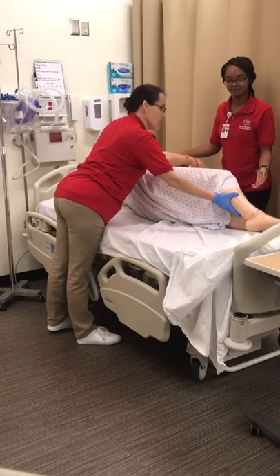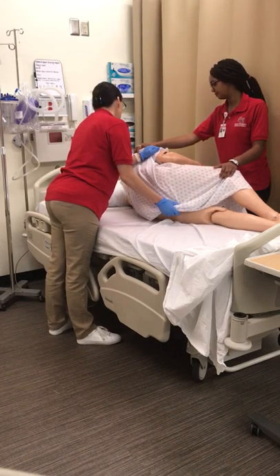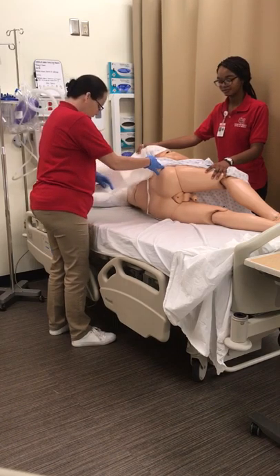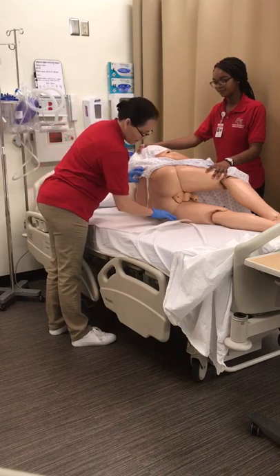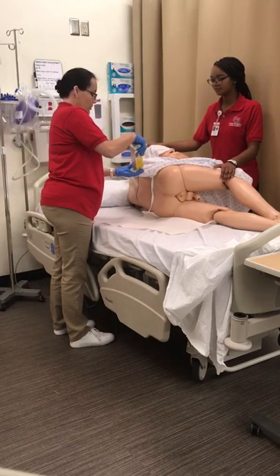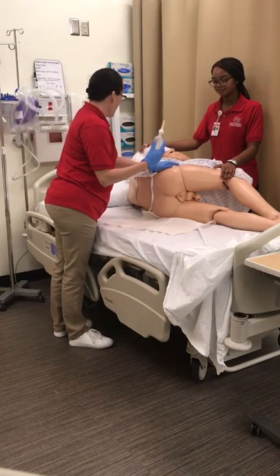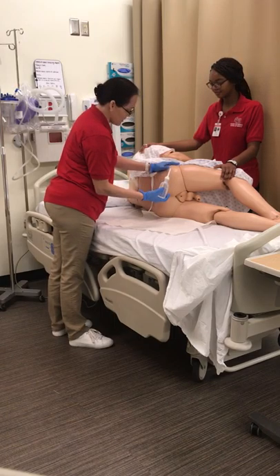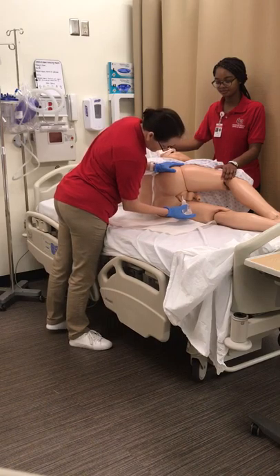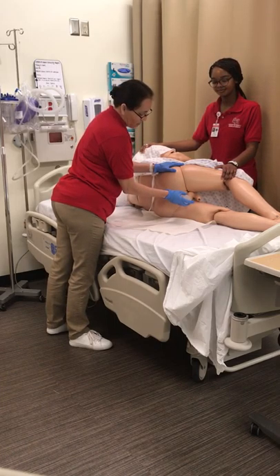Take your right leg and place it over your left, slightly bent. I'm going to expose your bottom and get ready for the procedure. How do you feel in this position? Are you okay? Place the pad under the bottom in case of any leakage. This enema is pre-lubricated, so no additional lubricant is needed. Remove the cap. I need you to bear down as if you're going to have a bowel movement, and I'll go ahead and insert it. You should feel a little pressure but no pain. I'll insert the tip three to four inches in a back-and-forth motion toward the umbilicus, and administer the entire volume of the container.